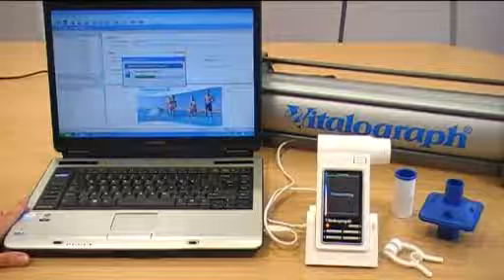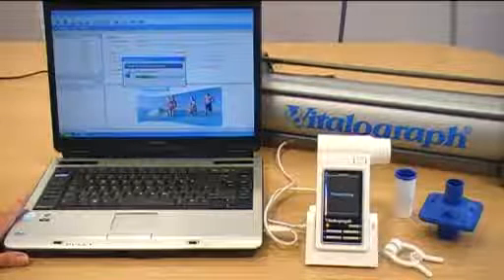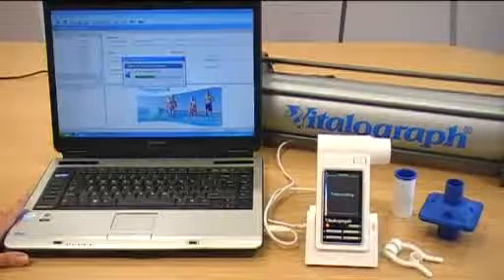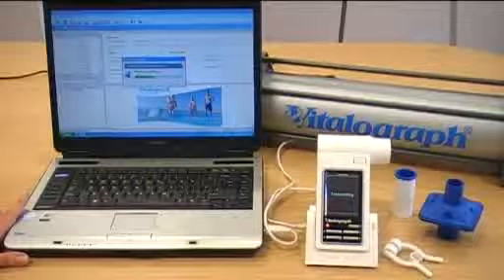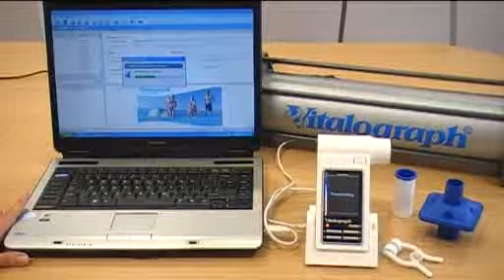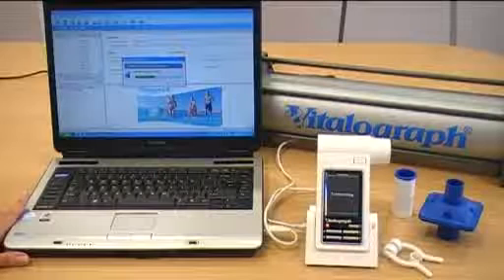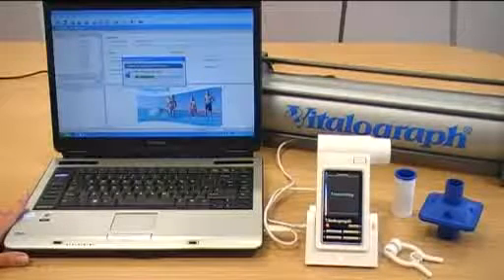The data is automatically synchronized and you can then generate reports. You can also have missing data fields completed. Spirometry standards and clinical guidelines recommend that an accuracy check on a spirometer be performed before testing.